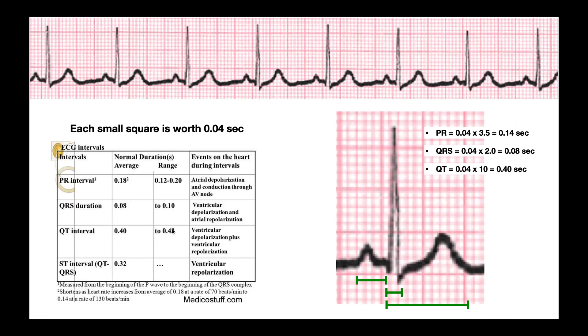And this is actually going to be normal for the QT interval. Again, with the QT interval, we just want to make sure that it's less than 0.43. Some sources will give you a normal range that has a lower bound. But generally speaking, we normally are just going to want it less than 0.43. And this is less than 0.43.